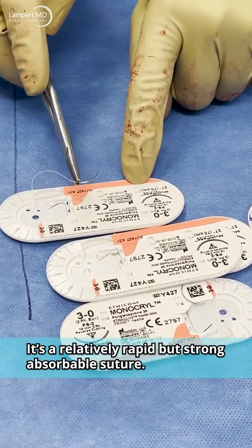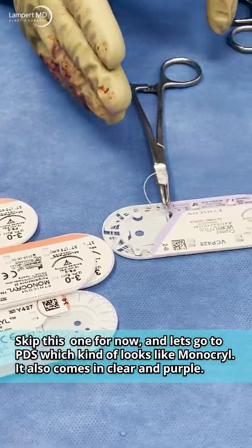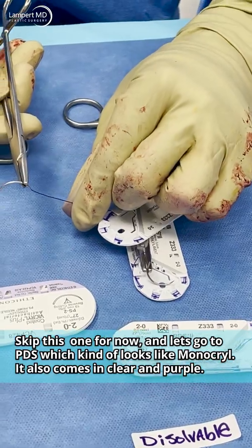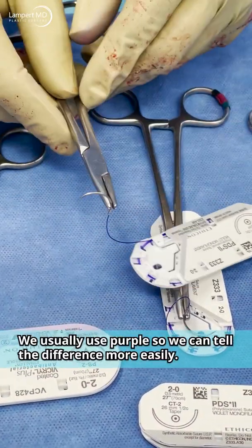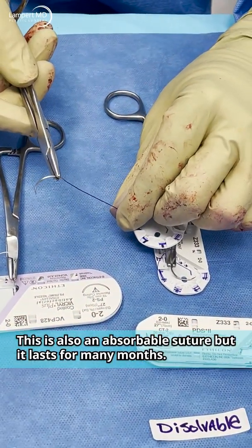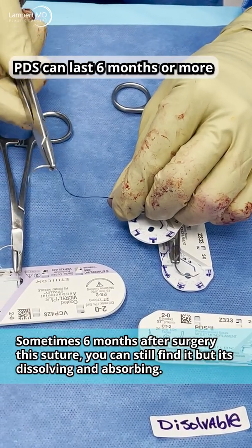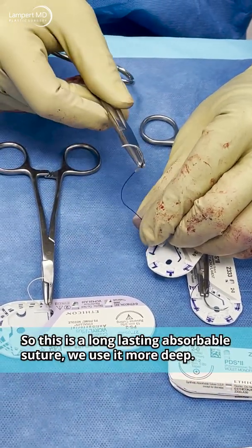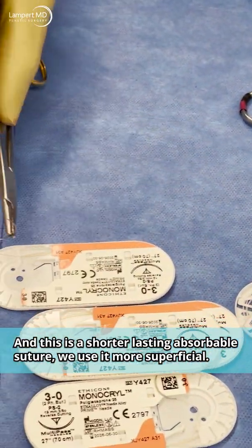PDS looks similar to Monocryl — it also comes in clear and purple, but we usually use purple so we can tell the difference more easily. This is also an absorbable suture, but it lasts for months and months. Sometimes six months after surgery you can still find it, but it's dissolving and absorbing. So PDS is a long-lasting absorbable suture used deeper in tissue.